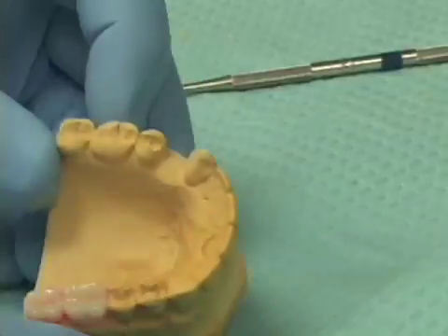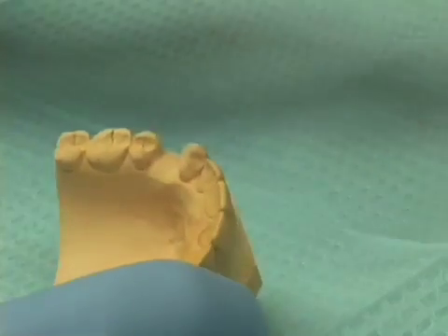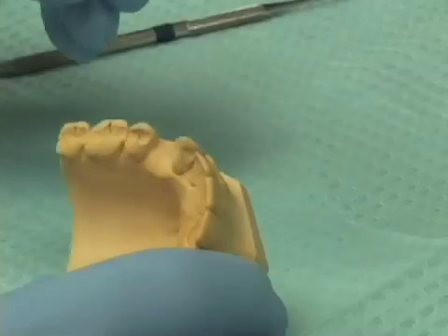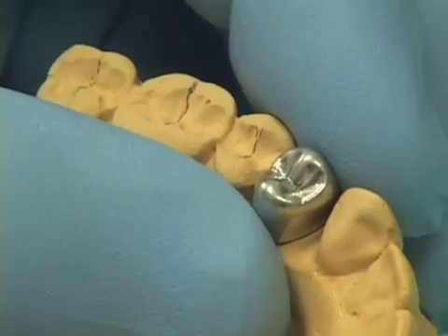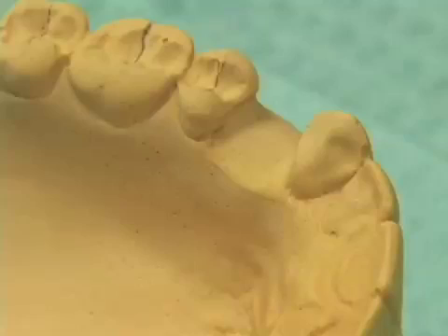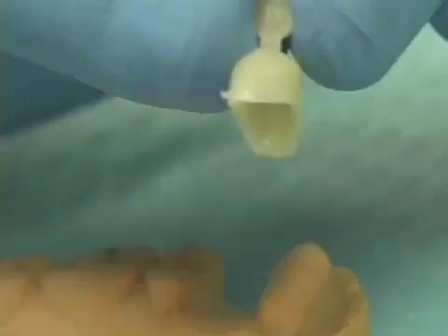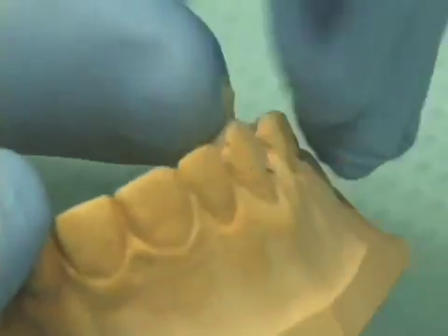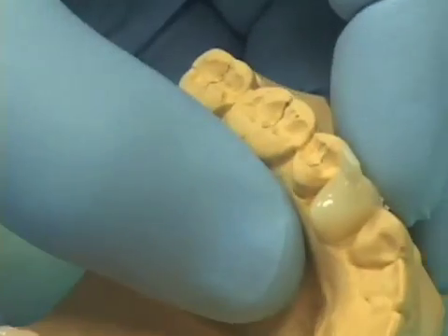In the area where we have a single tooth replacement, we may either set a single tooth in that area and make an impression, or we can take a prefabricated aluminum shell crown form which is available from the desk for bicuspids as well as molars. They also have polycarbonate crown forms at the desk — plastic polycarbonate crown forms that come in different sizes — and we can pick out one that's an appropriate size for the space of the tooth that's to be replaced.